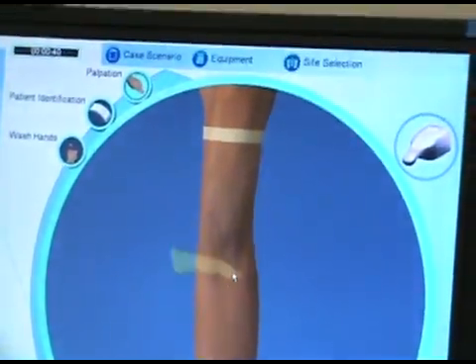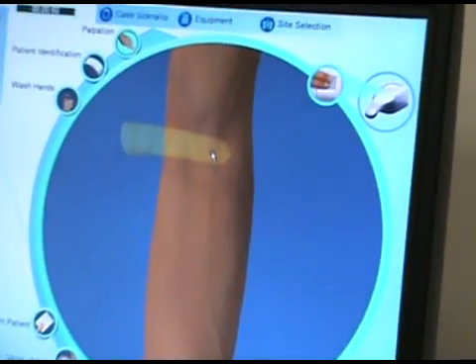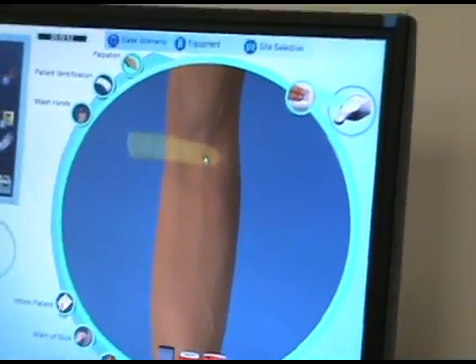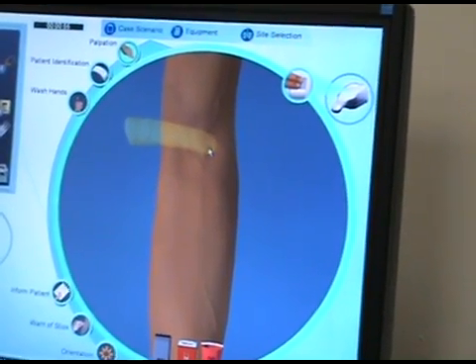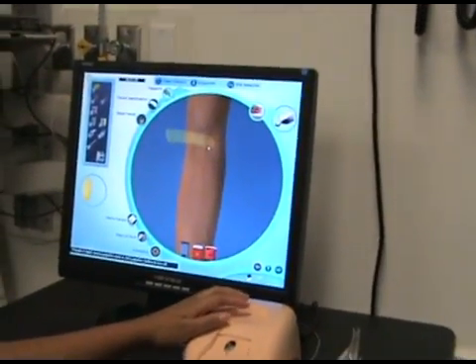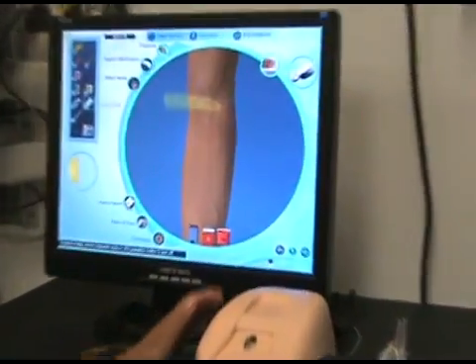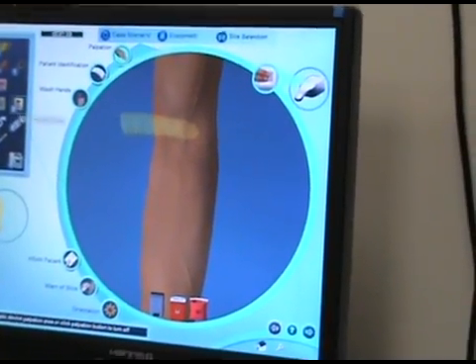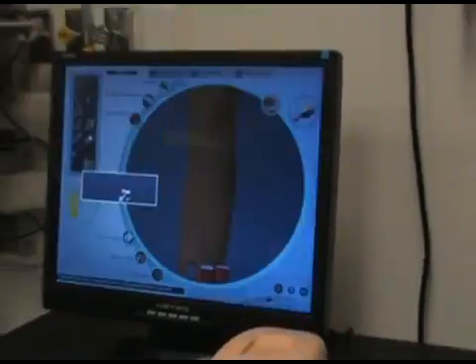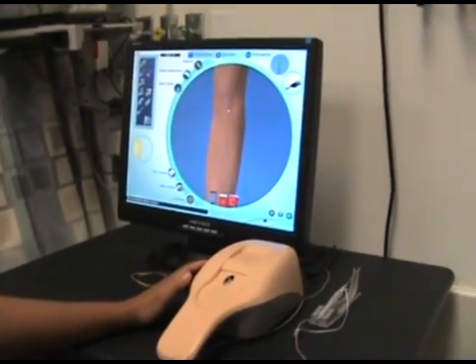Then you palpate. When you click here to palpate, you can actually enlarge it. Look at these nice veins. I'll go and palpate here — you can actually feel it. If you want to move it, you just kind of click. Once you find a good vein, you get one of your needles and you click on the side where you're going to start the IV.